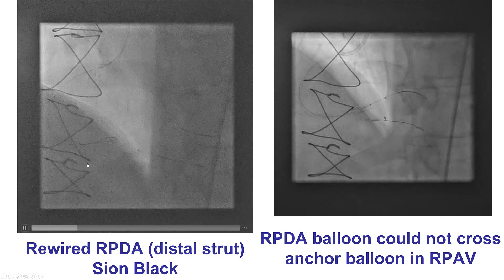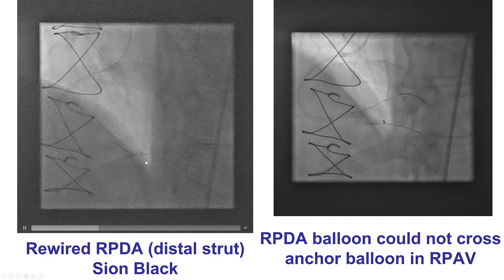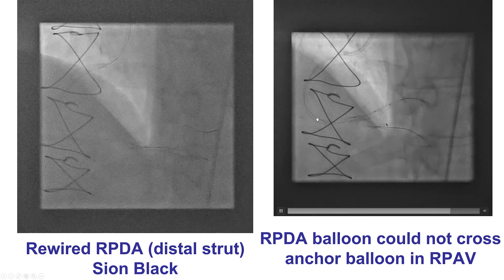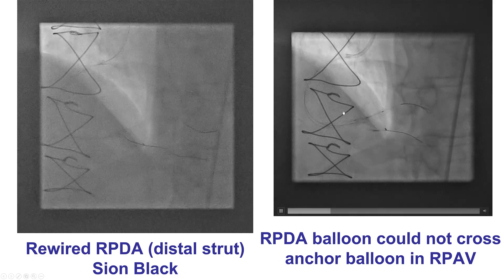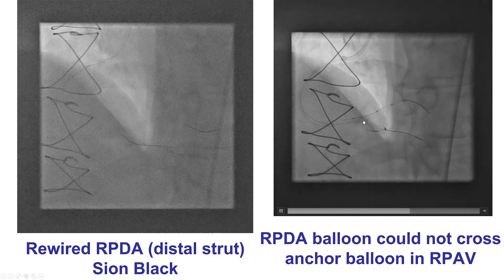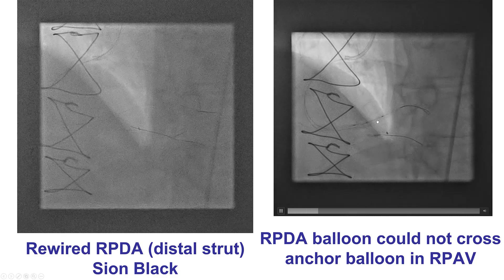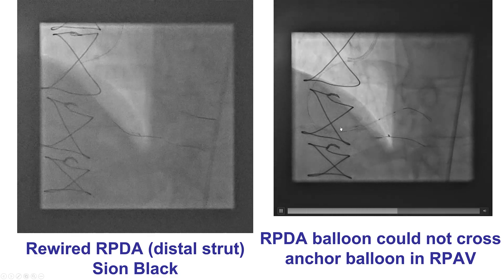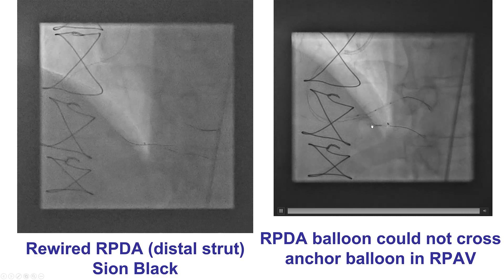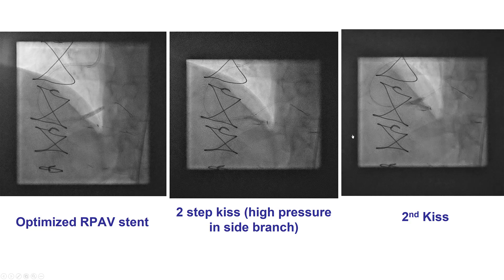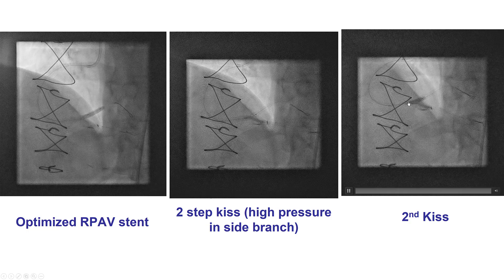The steps were then repeated. We rewired from a distal stent strut using the Sion Black again. We once again had difficulty advancing a balloon into the side branch, which is why we used an anchor balloon in the posterior lateral — inflating it there provided help with crossing a balloon into the PDA. After doing that, we did the kissing balloon inflation again. It is a two-step kiss: high-pressure inflation first into the side branch — usually 20 to 24 atmospheres — followed by simultaneous inflation at lower pressure, approximately 12 atmospheres, for both the main vessel and the side branch.